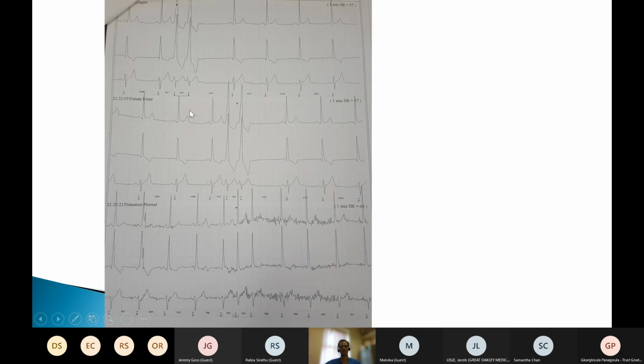And these you can be very reassuring about. We don't like the fact that there are two occurring together, but providing the patient's heart is structurally normal, they've got no family history of note, their 12-lead ECG is normal, I wouldn't do anything further about it. We could offer a little bit of beta blocker to try and suppress the palpitations, but it really comes down to the patient.